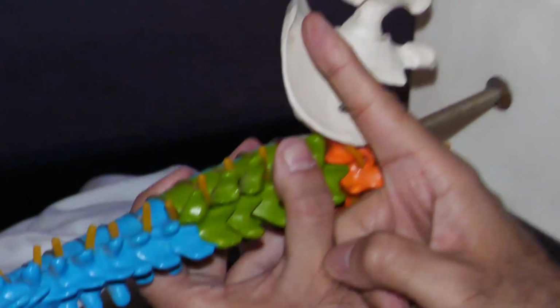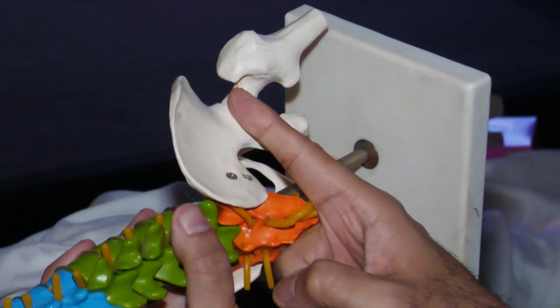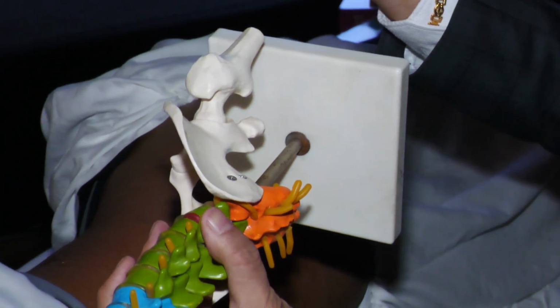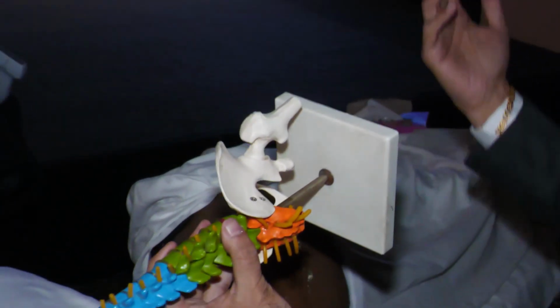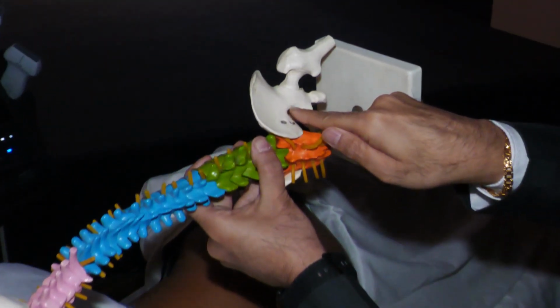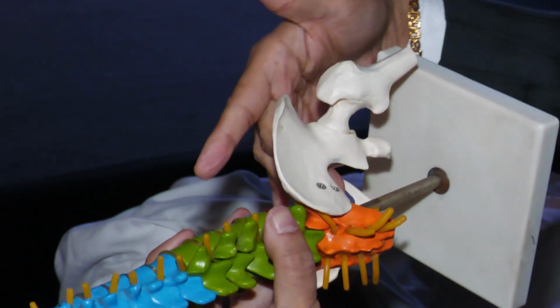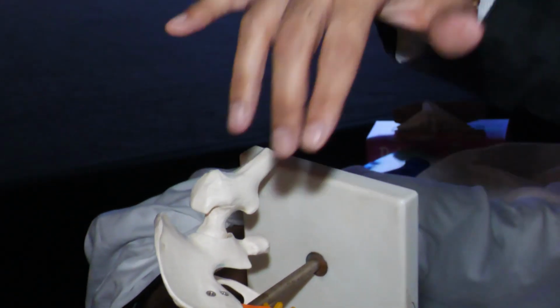Again, you will be at the ala of the ilium. Again, the job is to move your probe like this. Again, you will visualize the break in the ilium. What is that break in the ilium? The greater sciatic notch. Or alternatively, you can do an interfascial plane block, deposit the drug at the edge of the posterior border of the ischium. Because the plexus is lying just anterior to the piriformis, the drug will seep towards it.